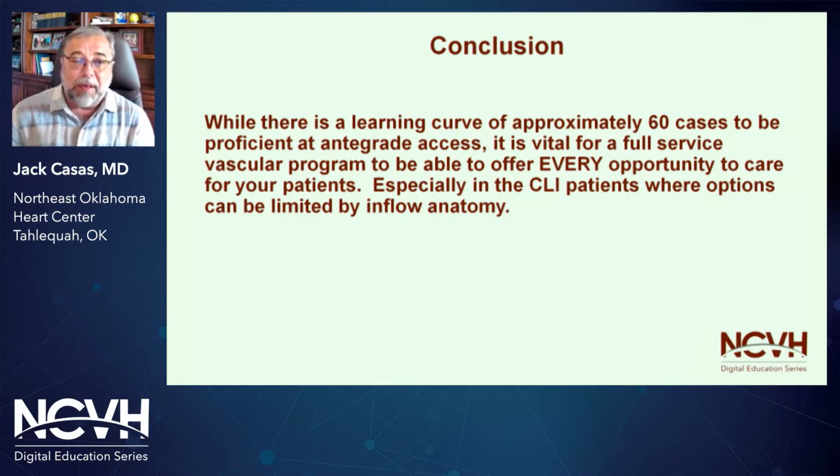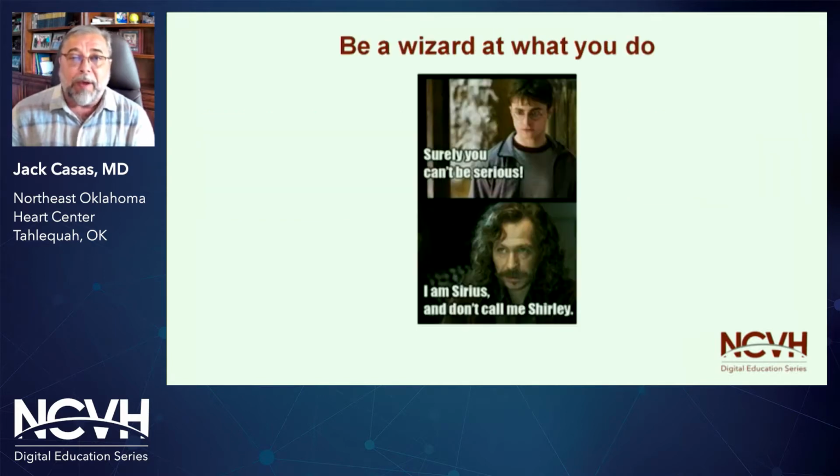In the CLI patients, you are going to have more issues because of the inflow anatomy, and antegrade access is probably one of your best ways to overcome the difficulties in crossing a CTO. So I advise, be a wizard at what you do.